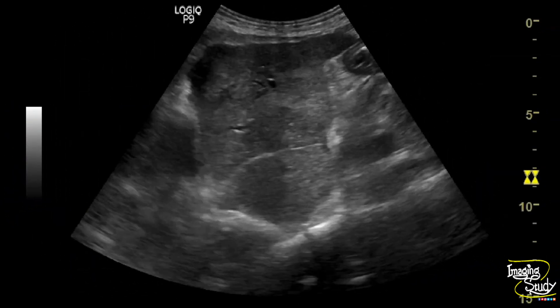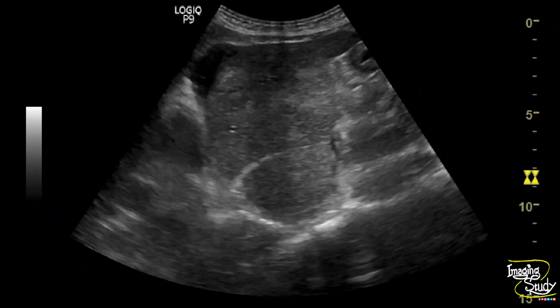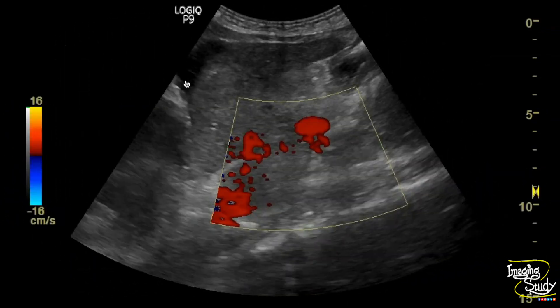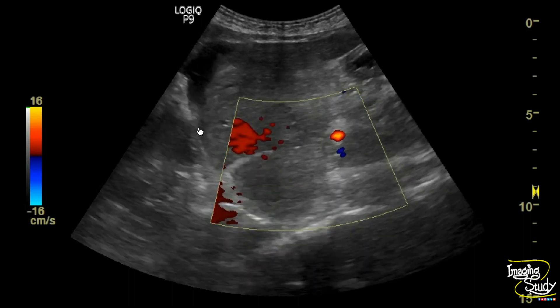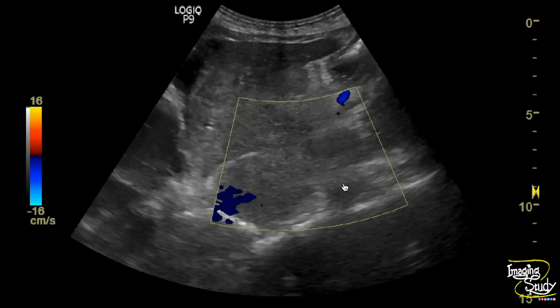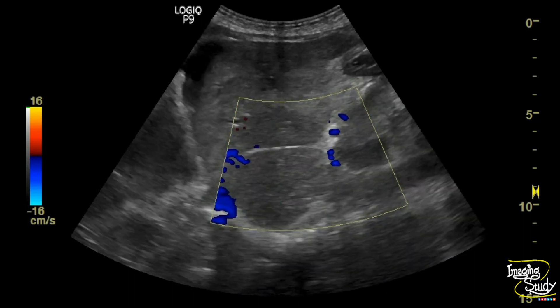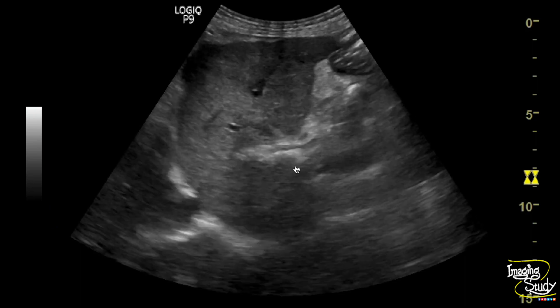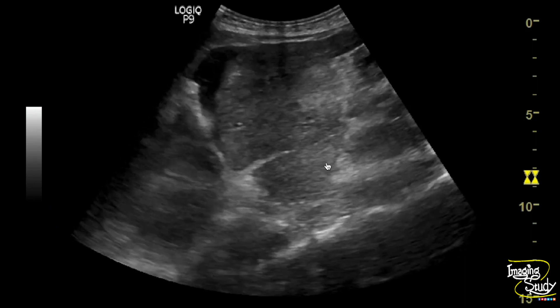Now let's jump into the left lobe. It also looks heterogeneous. You can see some ascitic fluid collection adjacent to it, and this part of the portal vein is not showing any flow on Doppler.